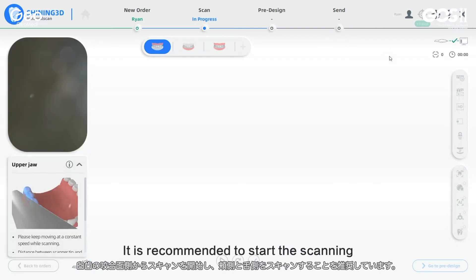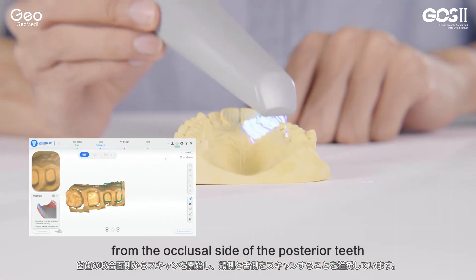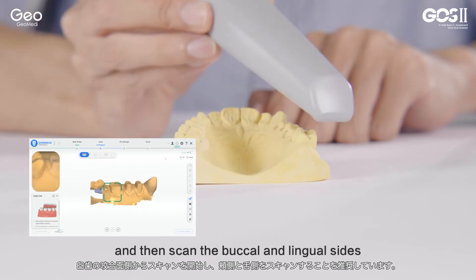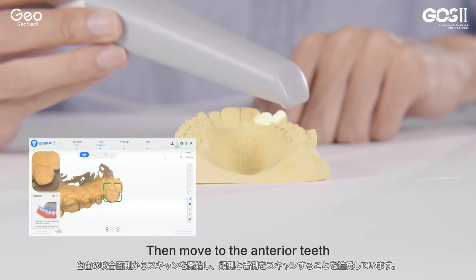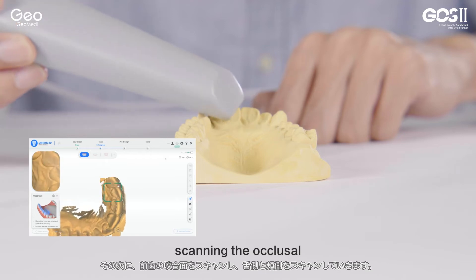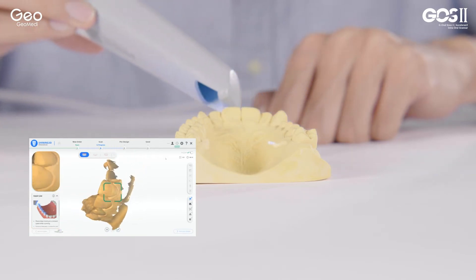It is recommended to start the scanning from the occlusal side of the posterior teeth, then scan the buccal and lingual sides. Then move to the anterior teeth, scanning the occlusal, then lingual and buccal sides.